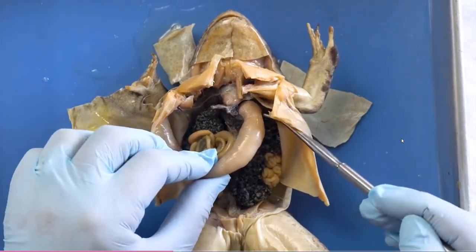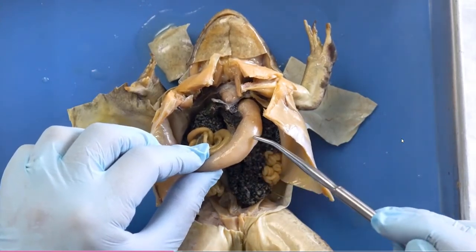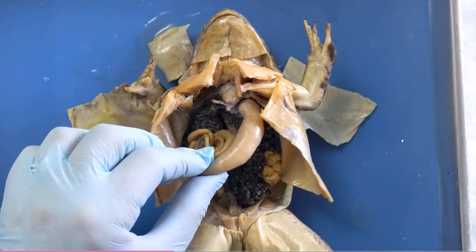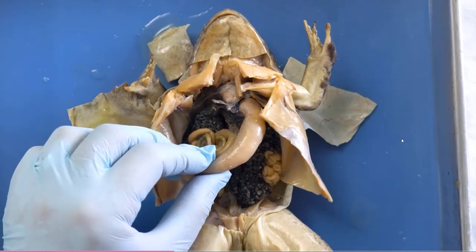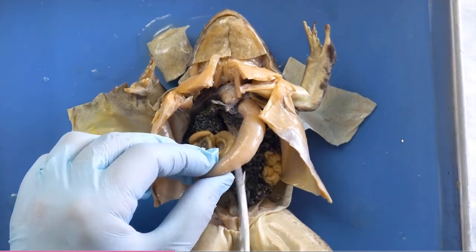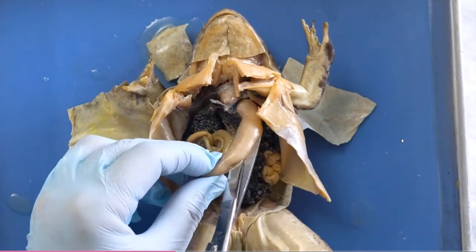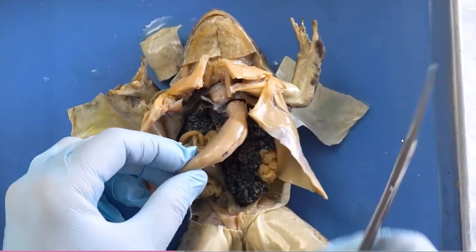I'm also going to open it for 2 reasons. It's really fun to see if there are any prey items found in the stomach. Also to look and see if there are any structures that we can investigate within the stomach to talk about their function. Just going to make a small incision here and then cut up this way.